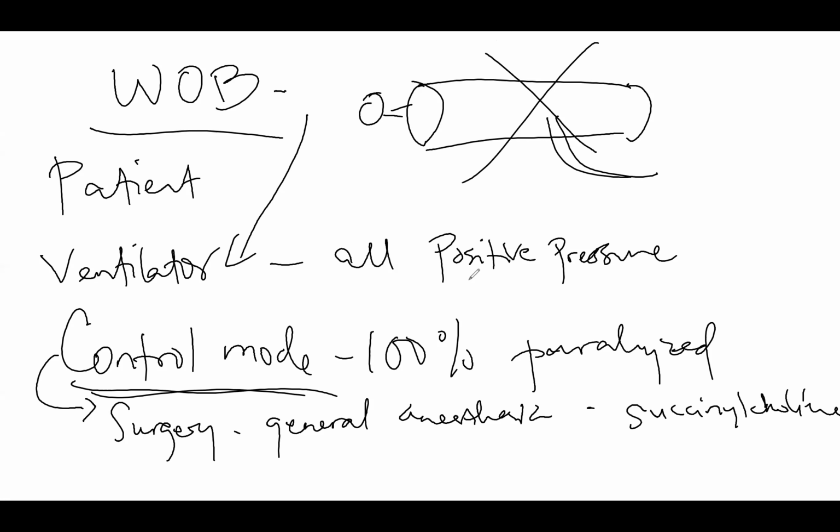So now came positive pressure ventilators. It doesn't work like our body. In positive pressure ventilation, the machine, the vent, has to push air into the patient's lung. So that is how our ventilators work now.